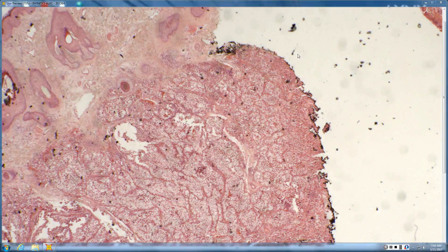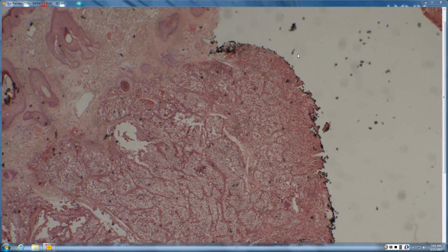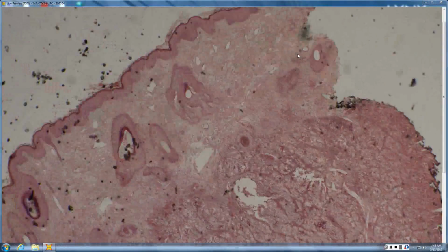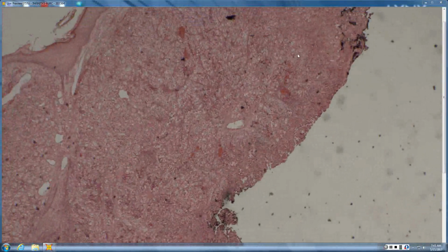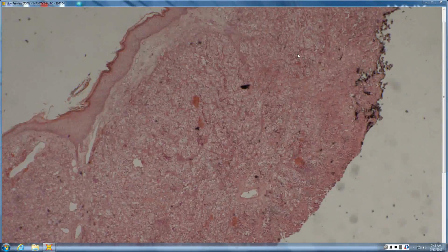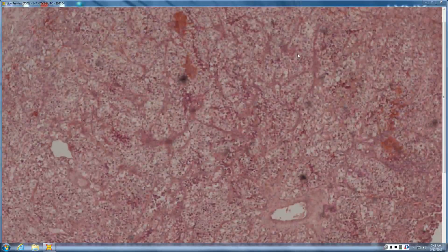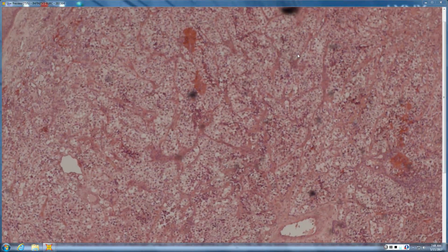Okay. Ying, you're up. In the first impression, there is a diffuse clear cell infiltrating the interstitium. So, in the first impression, I'm wondering if it's a metastatic carcinoma from renal. Very good. That's exactly what it is. Well done. Someone pass Ying the easy button. It's right in front of her. That was easy. Okay, very good.